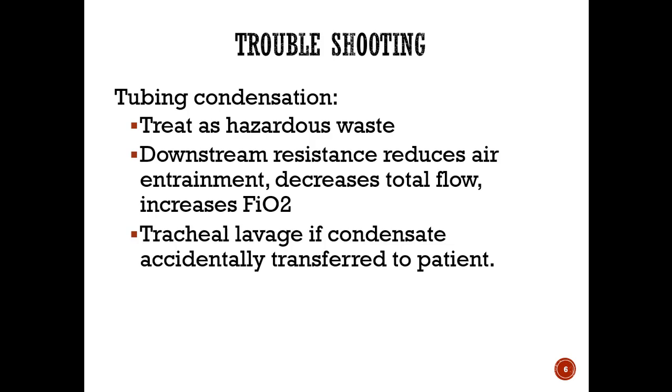And that is a problem for a couple of reasons. One, it's an aspiration. You never want to aspirate anything. But this is fluid that's potentially been sitting in a line, so you don't want to create an infection issue there. So just make sure that you're watching your lines and draining your lines.